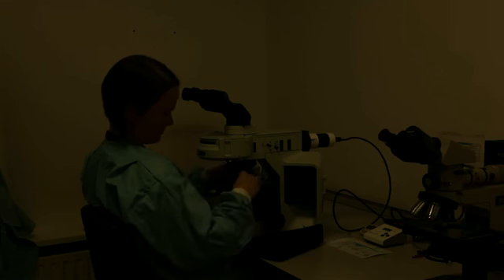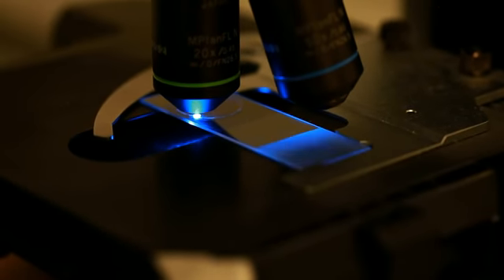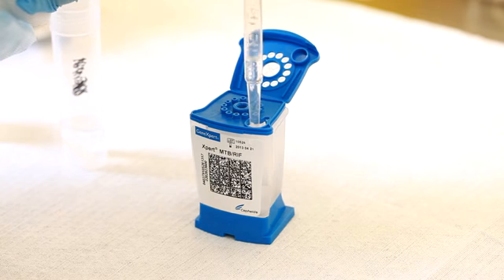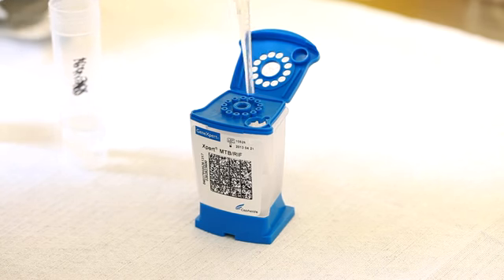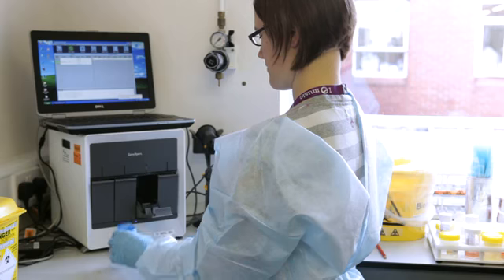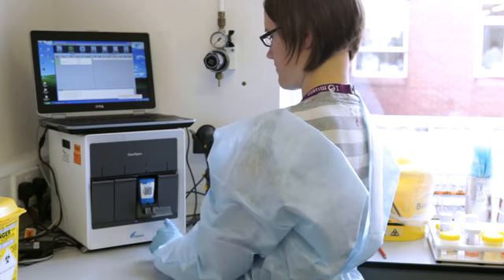The smears are read using an LED fluorescent microscope. The entire smear is read. Each slide takes a minimum of 3 minutes to read. This part of the process takes approximately 1.5 hours to 2 hours. A nucleic acid amplification test, NAAT, is performed on all new smear positive samples, or, if clinically requested, on smear negative samples. This is performed using the GeneXpert system.